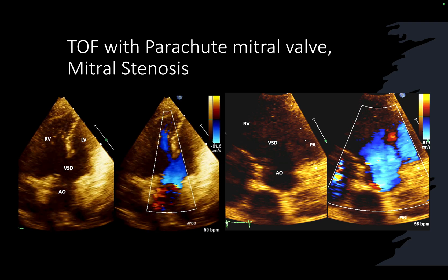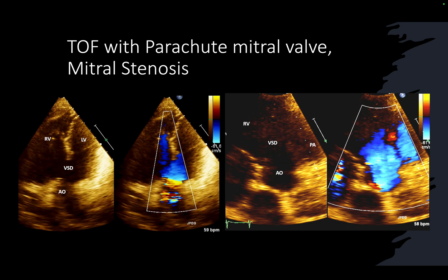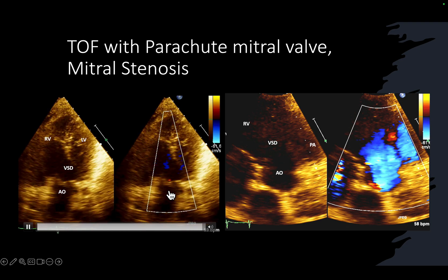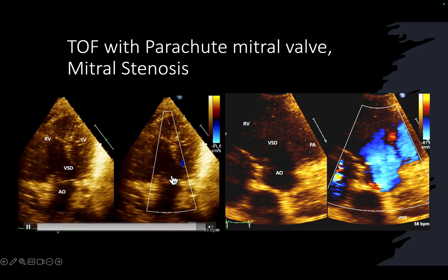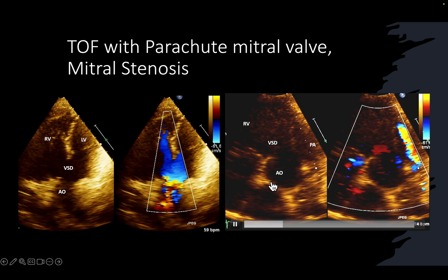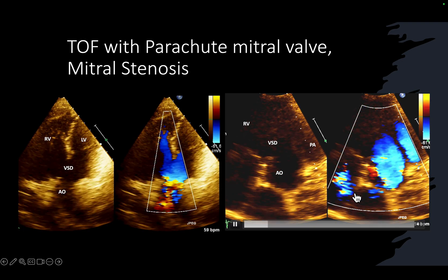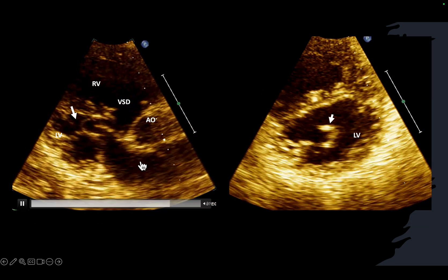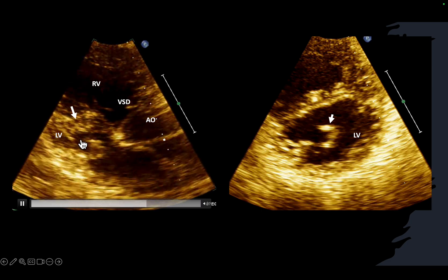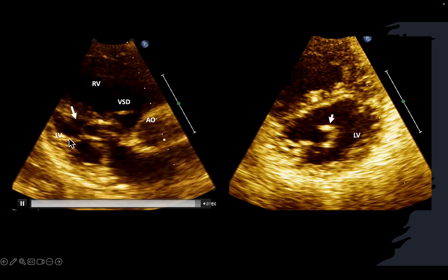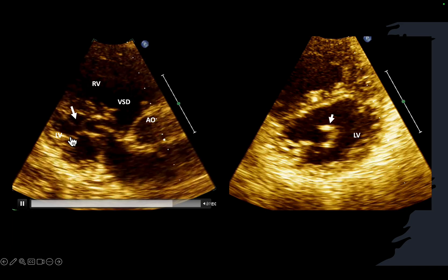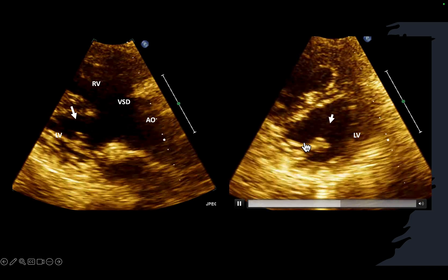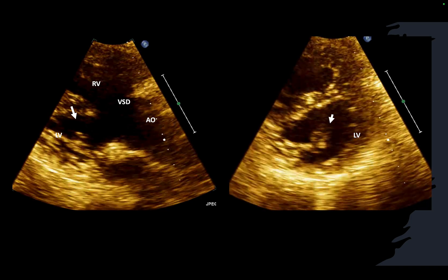Then you see this patient with tetralogy of Fallot — you see a large VSD, an aortic override from the right ventricle, left ventricle blood going to the aorta, mild aortic regurgitation, pulmonary stenosis, and mild regurgitation. But then you see the mitral valve — you see this kind of chordae. You thought this could be an arcade mitral valve, but this is attached to a single papillary muscle, which tells us this is a parachute mitral valve.